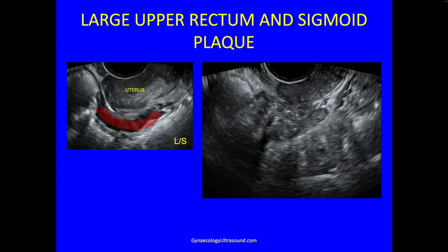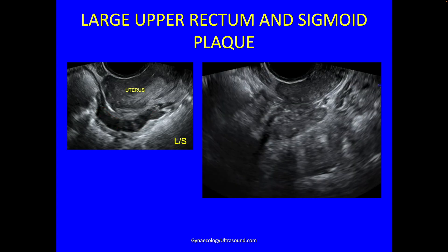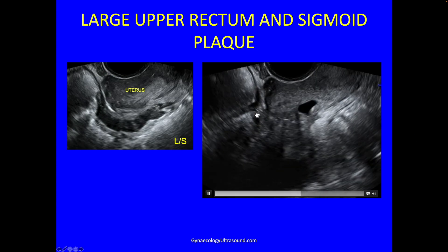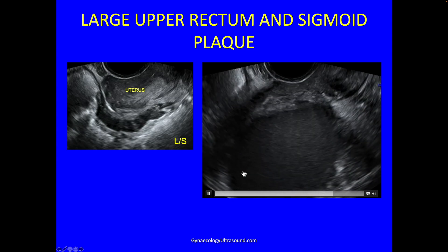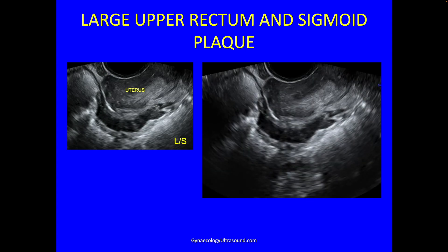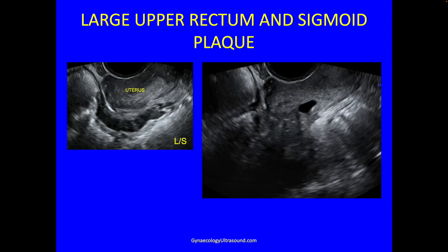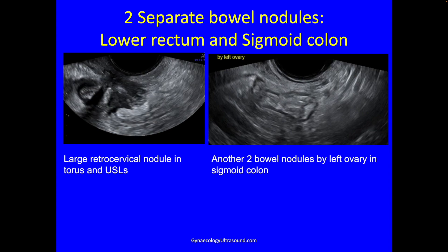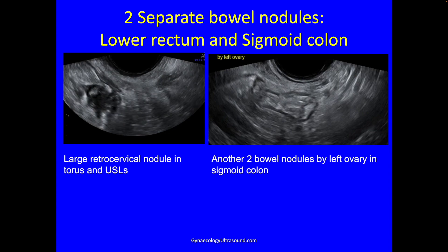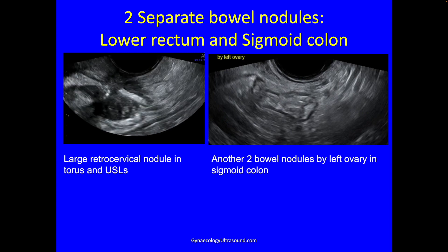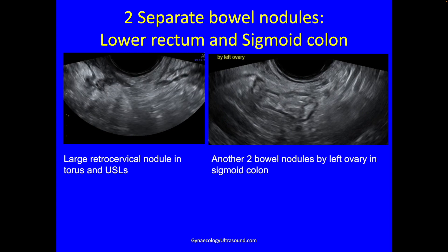This person had a very large upper rectum and sigmoid plaque of endometriosis. You can see it starts below the level of the fundus but goes up and over, and there's a big ovarian endometrioma there as well. Sometimes you have more than one bowel nodule — if you have one, you need to look everywhere else. This one is a very large stenosing retro-cervical nodule in the torus, in the uterosacral ligaments, and in the lower rectum.